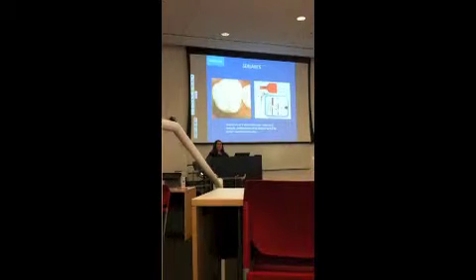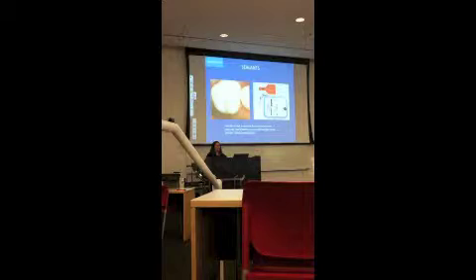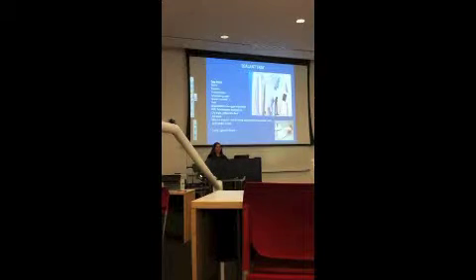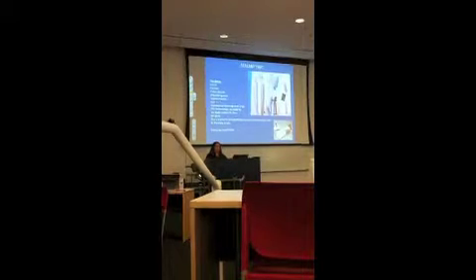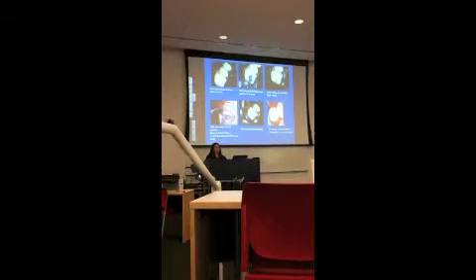Now, the biggest tip I can give you again is rivers over lakes, right? We don't want lakes, we want rivers. So you don't want to overfill the sealant. Okay, just another review of the setup. And this is the procedure.